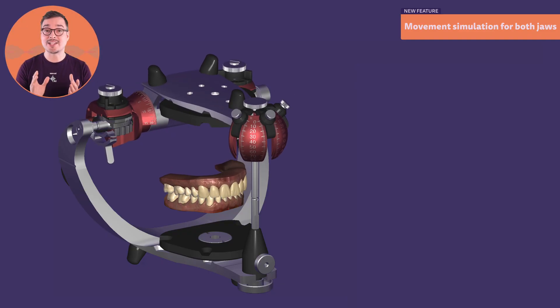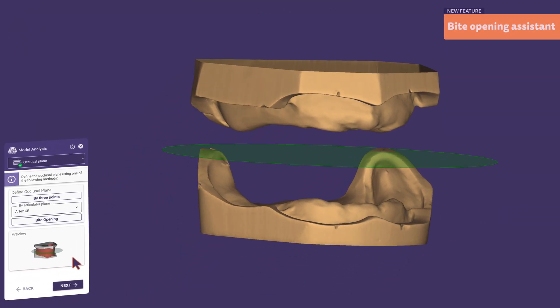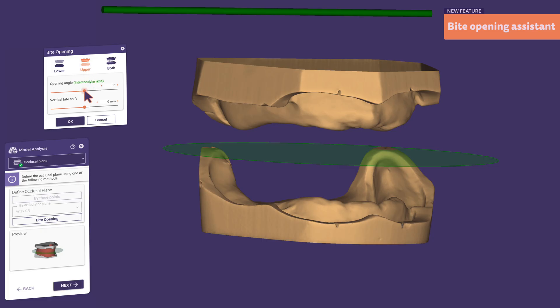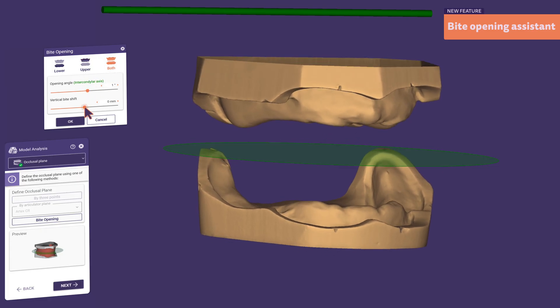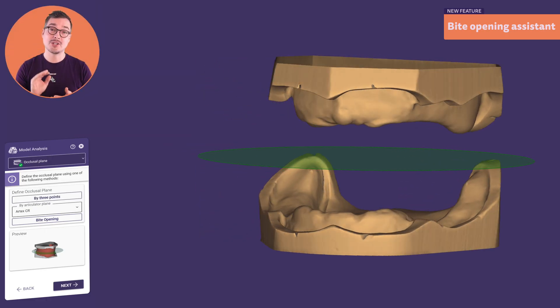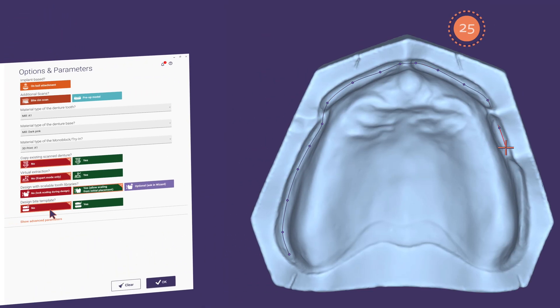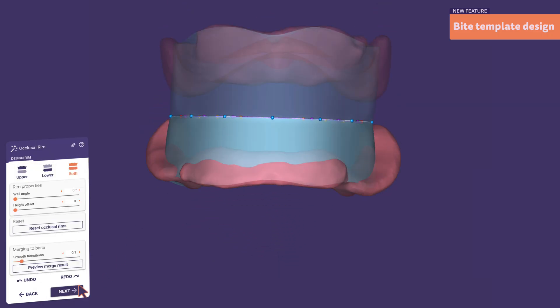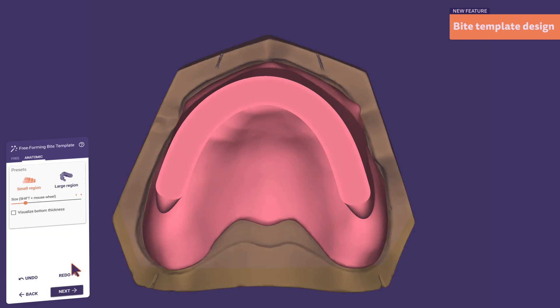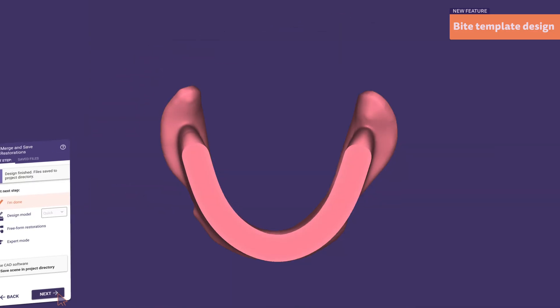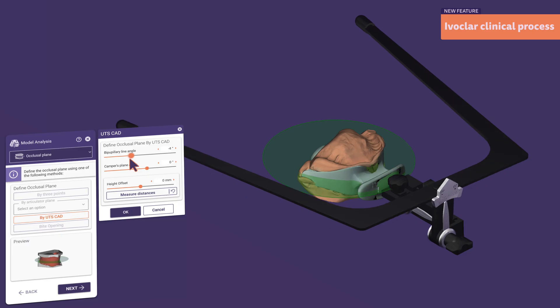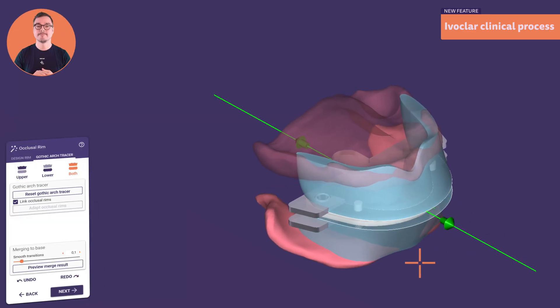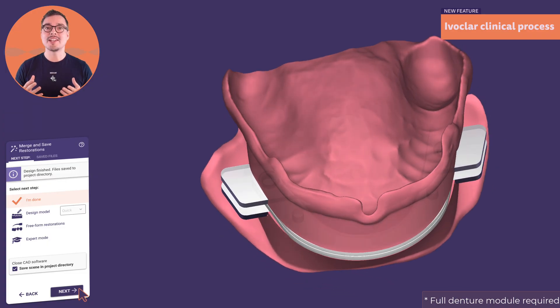The new bite opening option enables accurate virtual dimension adjustments for dual arch dentures. You can raise the bite around the articulator's axis by affecting the lower jaw, the upper jaw, or both jaws simultaneously, and shift one or both jaws independently. Bite templates are now available within the full denture module — simply select the new option, design both bases, and position the occlusal rim individually or by moving both jaws at the same time. You can also determine the occlusal plane using the Ivoclar UTS tray and add the Gnatometer tray to your bite template.